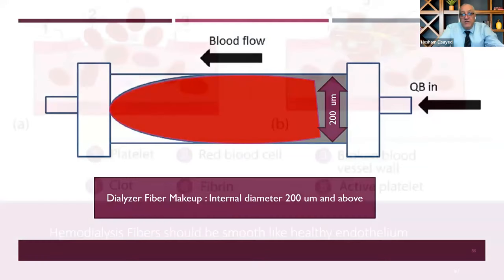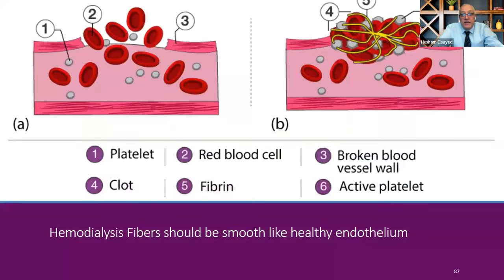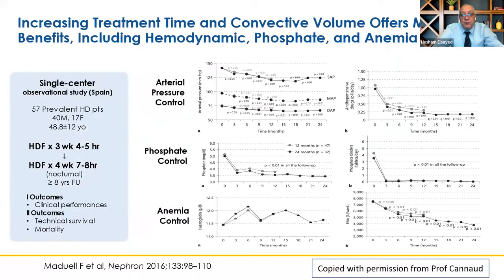So you need very smooth blood flow. You need less clotting. You need to optimize the blood flow. You can monitor that with the time. Time is a fixed value. Don't go below 4 hours.